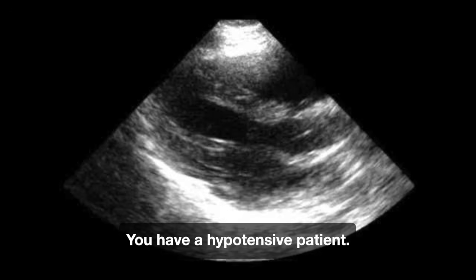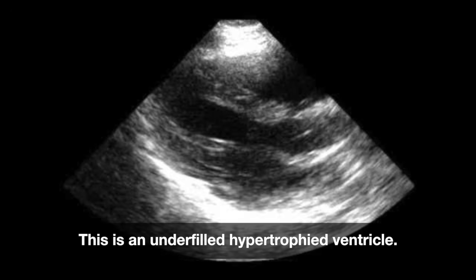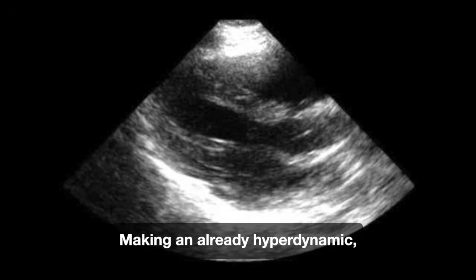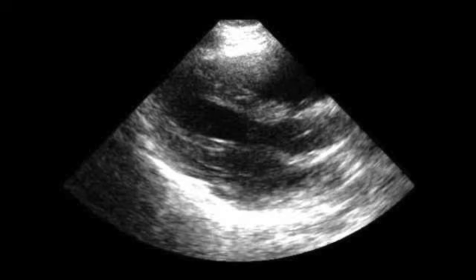A question for you. You have a hypotensive patient. On the parasternal long axis view, the left ventricle is small, thick-walled, and almost completely obliterates during systole. What are you going to do and what are you going to avoid? This is an underfilled hypertrophied ventricle. Give fluid cautiously and avoid immediately reaching for an inotrope. Making an already hyperdynamic, obliterating ventricle contract even more forcefully may worsen the obstruction and reduce the blood pressure further.